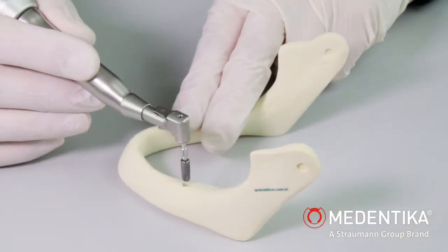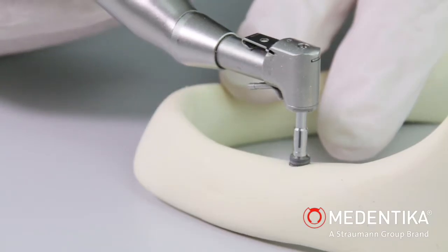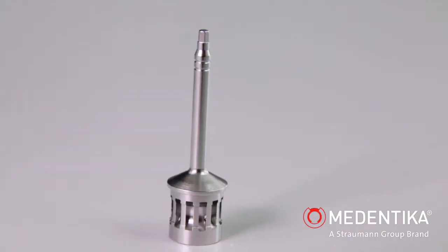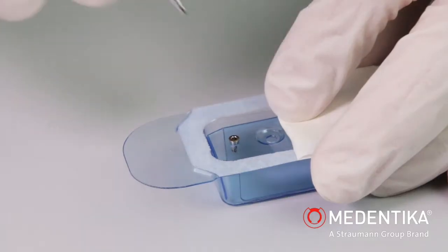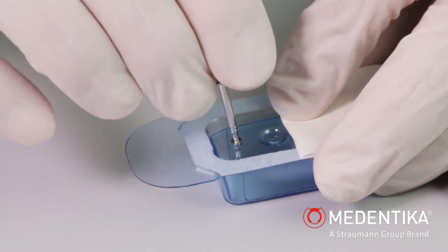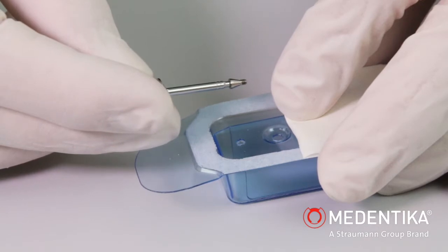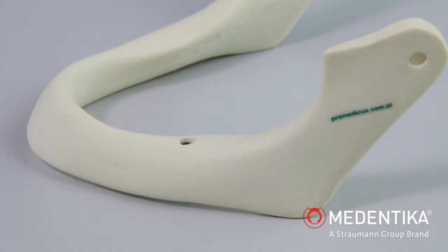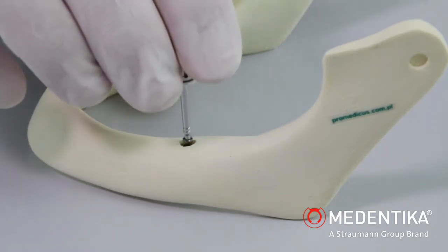If the implant is intended for submerged healing, a closure screw must be fitted after removal of the placement instrument. The closure screw should be removed from the sterile blister pack using the hex 1.26 mm placement instrument, and then inserted hand-tight into the implant.